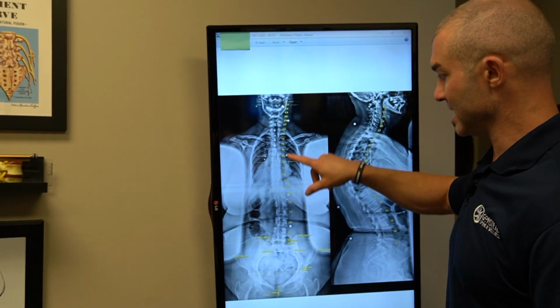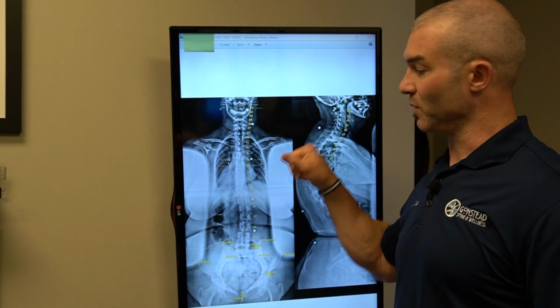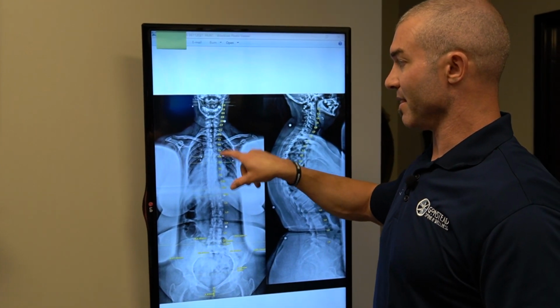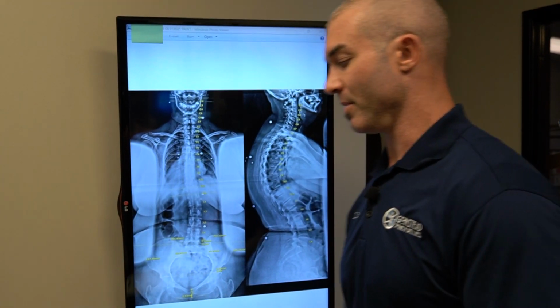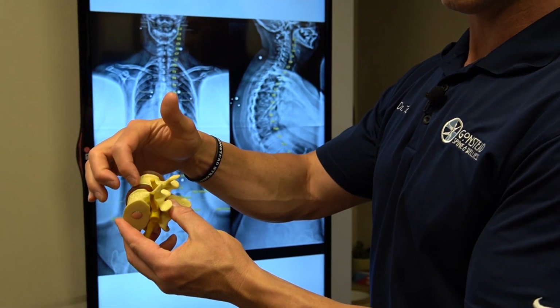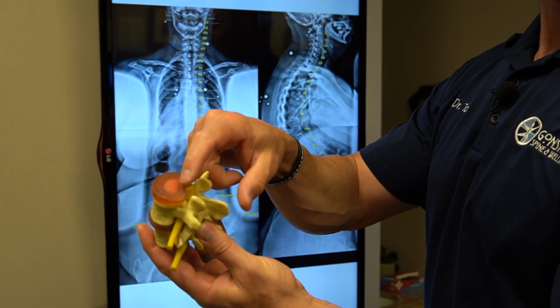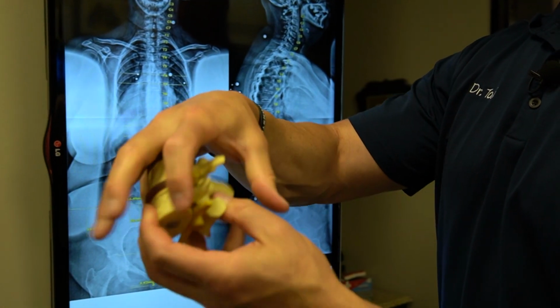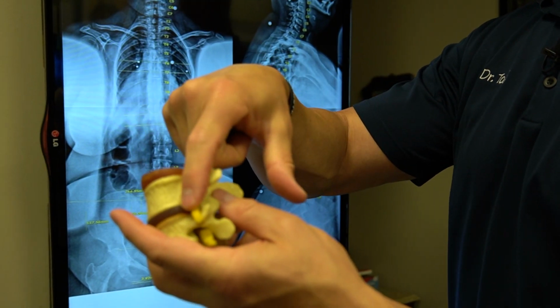You'll see these little white dots on here. Those are BBs that we tape on a patient's spine. The small ones are freckles and moles and scars, and the big ones are where we found a problem in the spine, AKA a subluxation. Front of the spine, back of the spine, bone, disc, bone, nerve in between, spinal cord down the middle. With trauma, bones shift, disc, joint, other stuff swells, irritates the nerve.